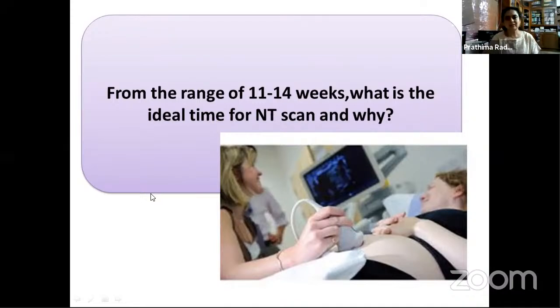Well, I think it's not like one fixed answer to this question, to be very honest, especially in the era of NIPT. We know the risk assessment for NT screening is better at 45 millimeters. Your biochemistry is there. So it's only the nasal bone unossified. I will look at the NT. NT is looking normal. Your biochemistry is normal.